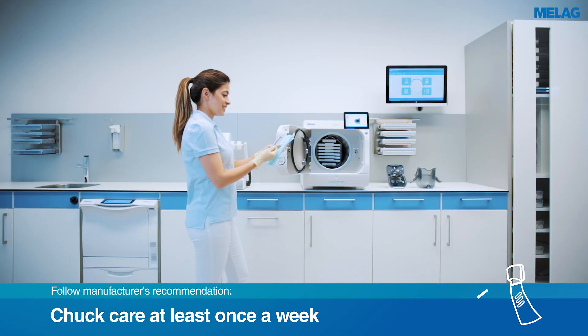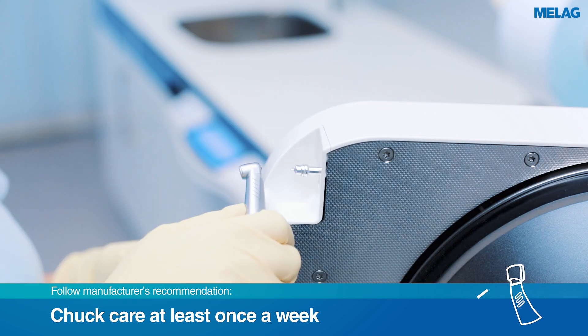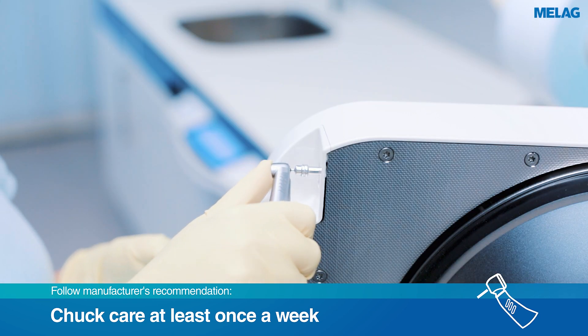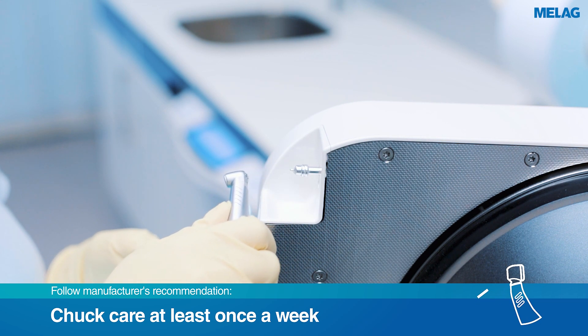For proper oiling of the instrument head, please hold down the button of the instrument during the care process. Then press the instrument briefly on the nozzle until oil comes out at the instrument head.